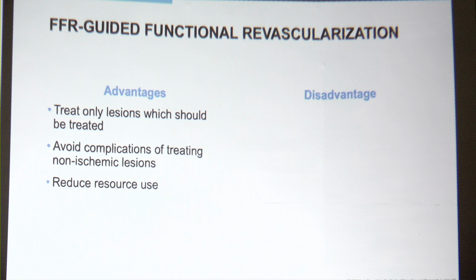It avoids the complications of unnecessary PCI, although you may say PCI in your hands is very, very safe. But with the aging and complex cases that we see, I think it is valuable to avoid unnecessary PCI. And as I just said, it reduces resource utilization.